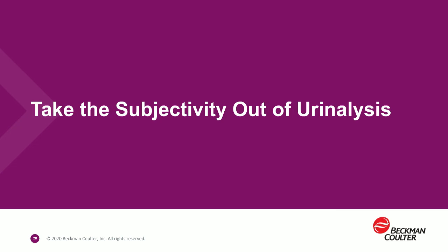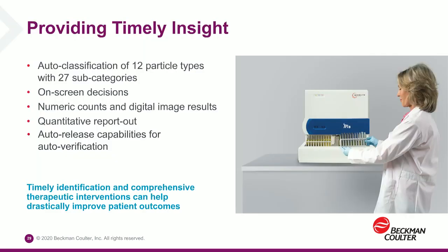Thank you, Dr. Ness. That was great information. And as we know, your lab has very important testing to perform. This is why we want to help you take the subjectivity out of the urinalysis test.